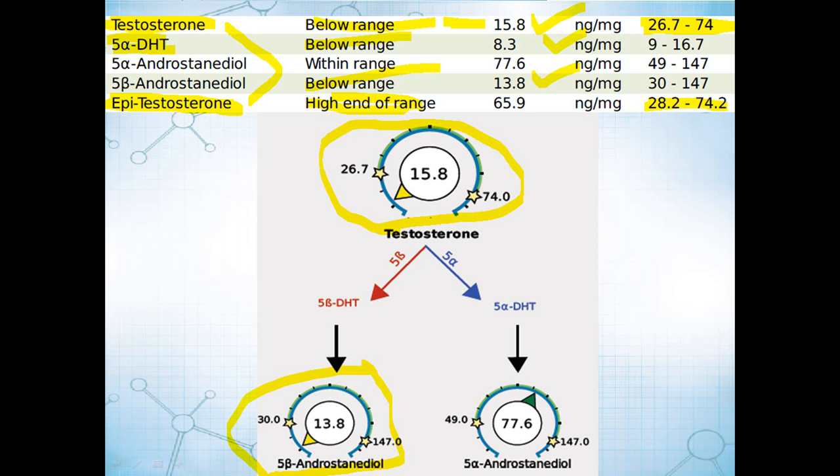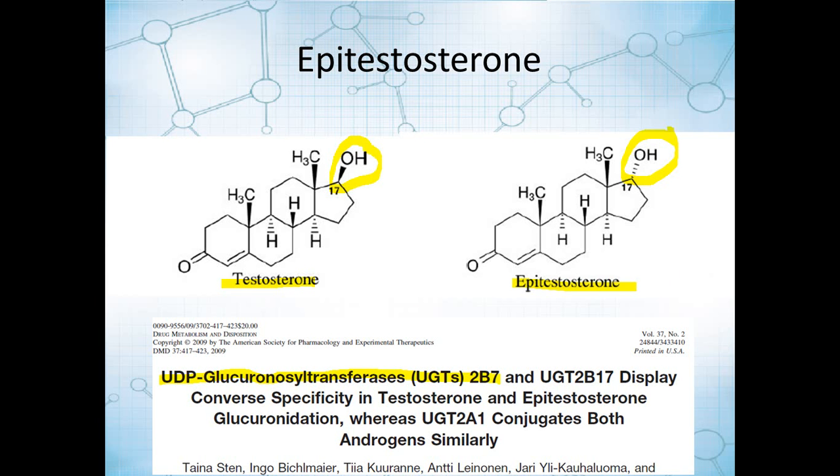It's really rare. We've seen it maybe 2 or 3 times in a couple of years, so it doesn't happen very often. It happens to be more prevalent in people of Asian descent, so something to keep in mind. This particular gentleman's result here is actually of Asian descent, which is why we ask that question on the requisition form. And again, when we see the pattern, we'll alert you.